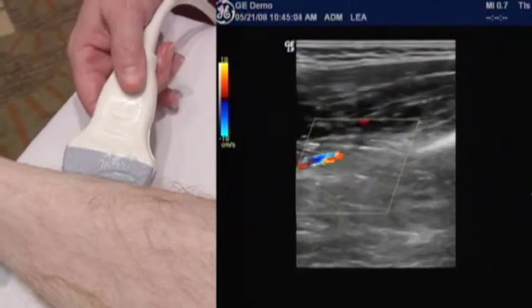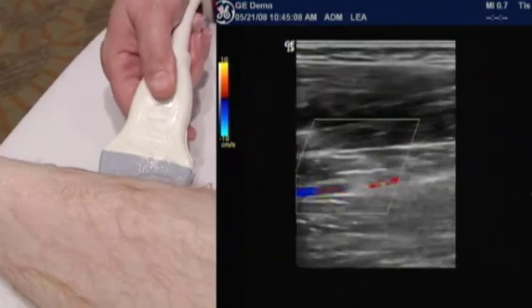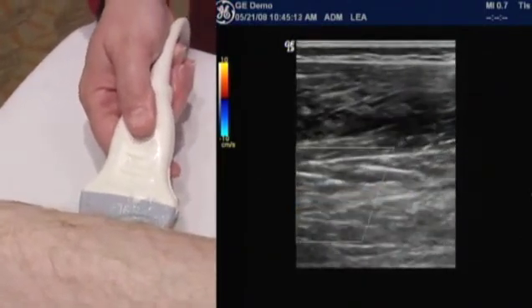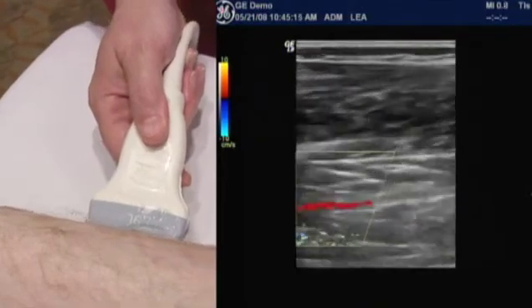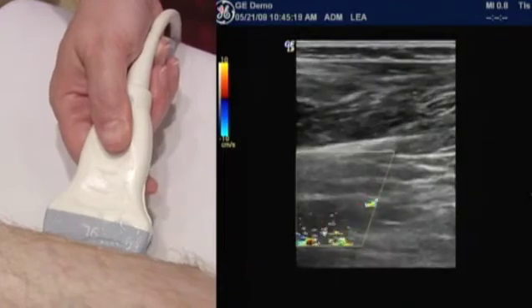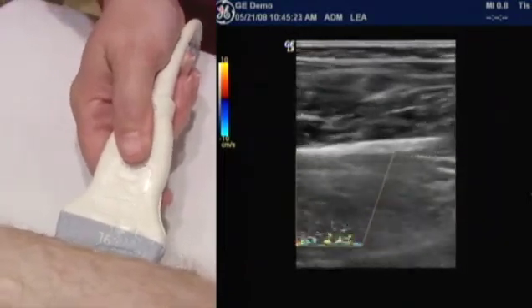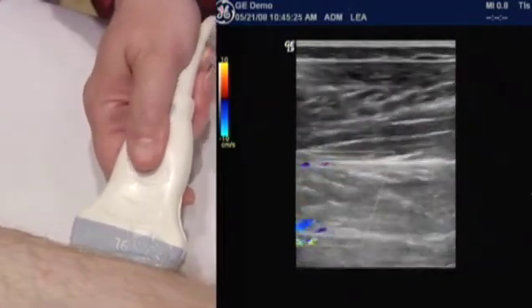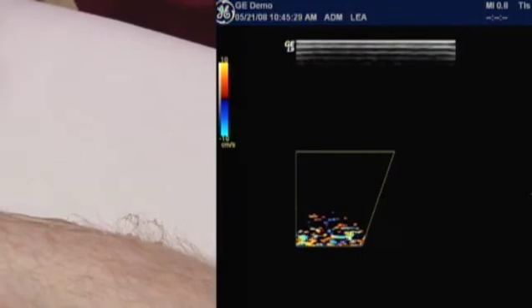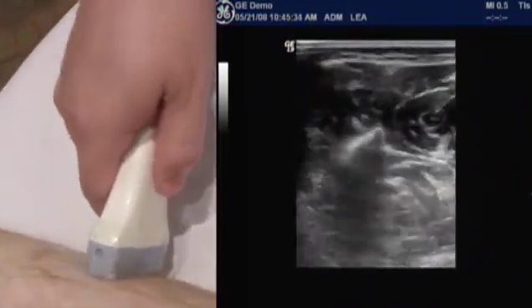And again, I'm kind of over off to the side of the tibia. And here it's just a little bit easier view. I think as I turned him, some of the muscles got extended, some of the tendons a little bit, and it just sort of pushed things a little bit more out of view. Now we should be able to come up and follow it. We're still losing it a little bit here, so I'm going to see what I can follow more in transverse.